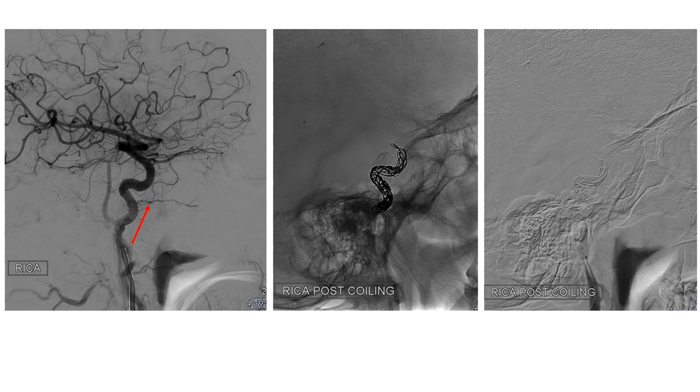There is an option of placing a balloon in the internal carotid and doing an Onyx injection percutaneously. However, I don't do that. Even if there is a 1% or 2% complication, I don't accept it. And Onyx embolization occasionally, even with balloon, can lead to issues, and I'm not very keen to have complications in my hand in these elective patients. So this patient underwent sacrifice of the internal carotid artery.